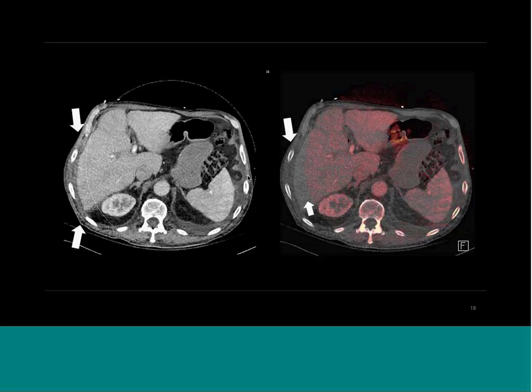This is what happens, okay? If we don't center the patient correctly, you got to really keep in mind, what are we scanning, okay? What do we really want to keep within the dual energy field of view? For the most part, it's everything within the peritoneal cavity, right? All your solid organs. But occasionally, it may be that a patient has something in their skin. Maybe they have a tumor in the skin, and that's exactly what we need to image. So sometimes it does require us to figure out, okay, what is the clinical question, and let's scan appropriately so we're covered in the dual energy field of view.